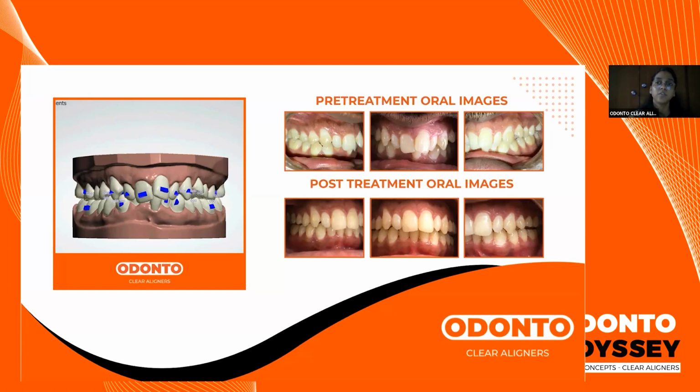There's an extensive form that we want the provider to fill out when sending in a case. That helps you communicate to us what you wish in terms of treatment outcome. What is the patient looking for? Aligners are a very aesthetic treatment modality, so patients come in with a very specific idea: we want a particular correction, we want just the anterior correction, this is my main concern, this particular tooth is bothering me because I feel it's too out.